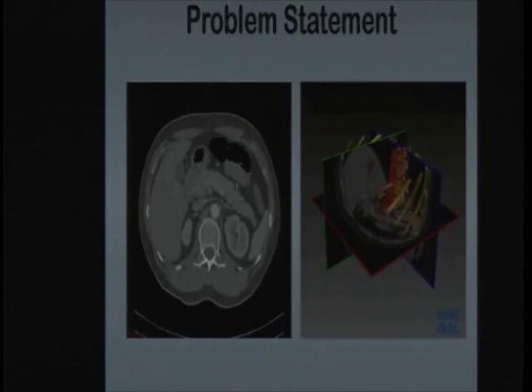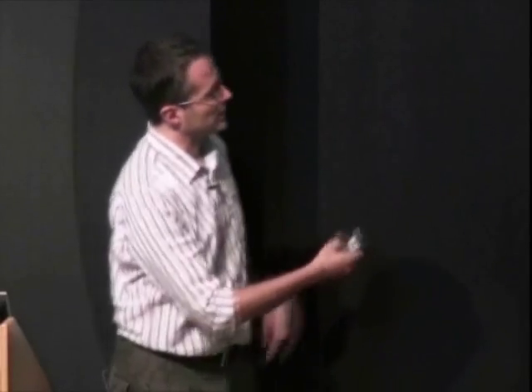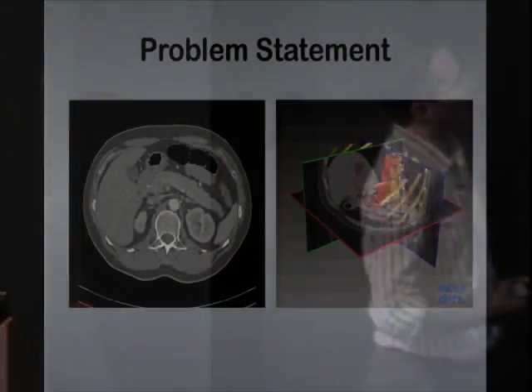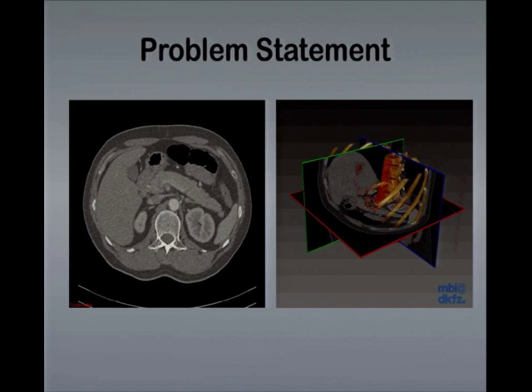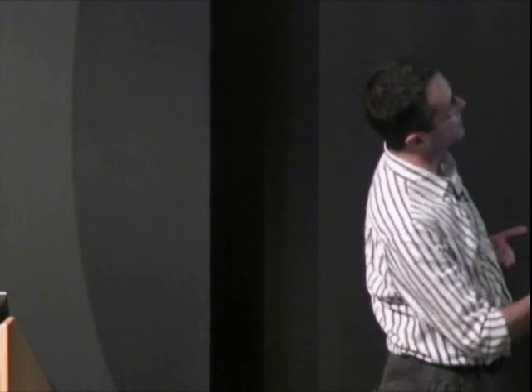This is a CT scan, which is a little bit like X-ray. So you can see the bones very well. This is a horizontal view across the abdomen of this patient. So here we've got the spine. Actually, this is close to the thorax as well because I can see a little bit of the ribs. You can see them in 3D here.